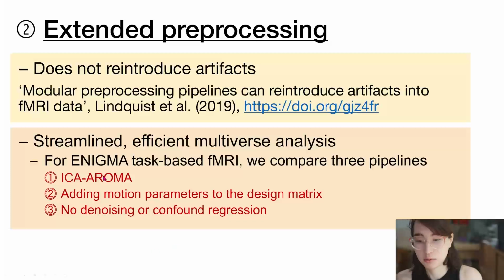Am I doing ICA-AROMA? Am I not doing ICA-AROMA? This will help us understand. I'm sorry, I have a bit of allergy. So this will really help us understand what these steps are actually doing to our data, and not just in general, but in the specific case of what we are doing. So this is supported by HALFpipe, but not enabled by default.